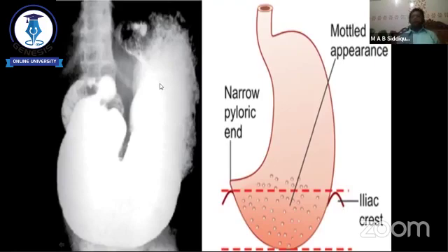So in case of contrast X-ray, you cannot conclude the whole thing, but due to the limitations of OSPE, there is no scope to show you multiple X-rays. That's why we show a single X-ray with a scenario base, so you understand what we actually want, or what is needed in the exam.